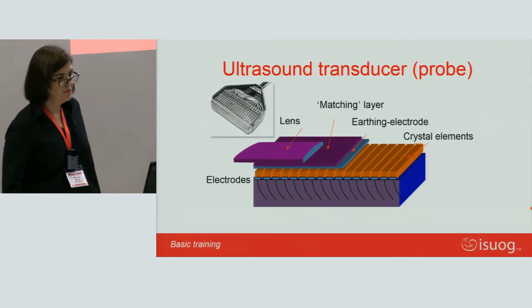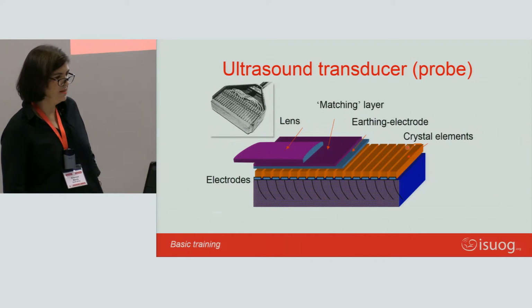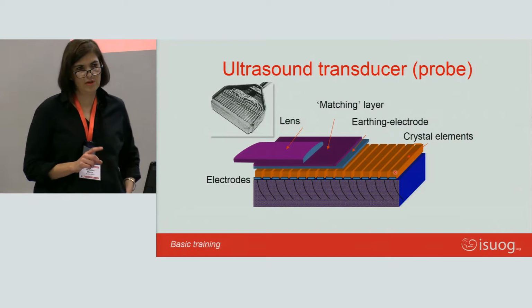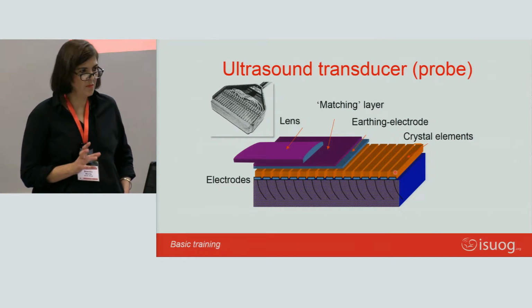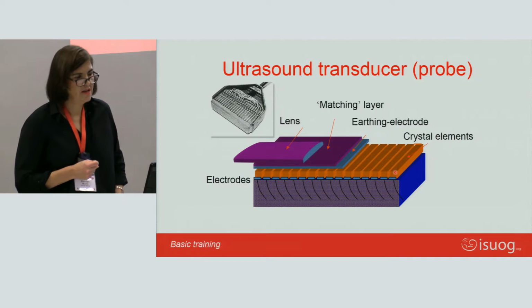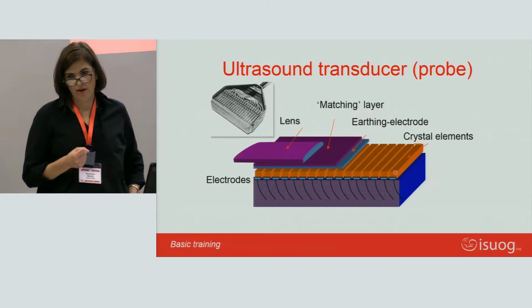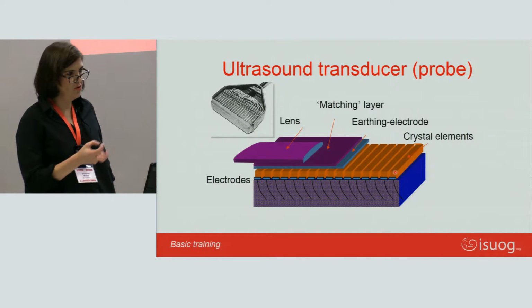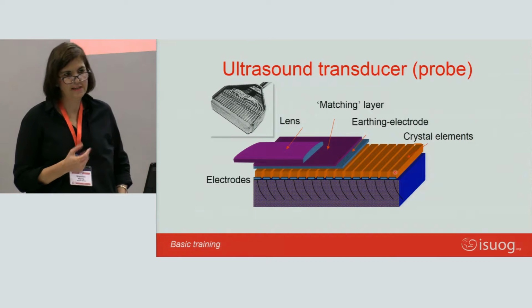Now, the ultrasound probes, this is just a nice example of what it looks like, and these are the piezoelectric crystals inside the probe. And just on that note, I just want to say that that is probably one of the most expensive parts of your ultrasound machine. And I often come to the probe when I scan and I see people have left the gel caked all over the probe. They haven't cleaned it.